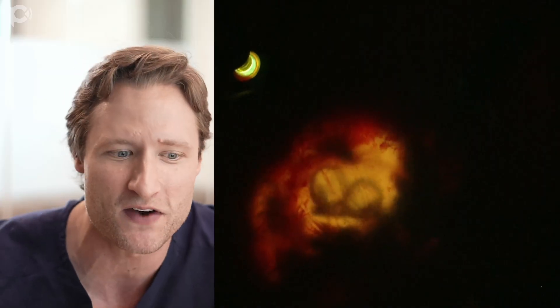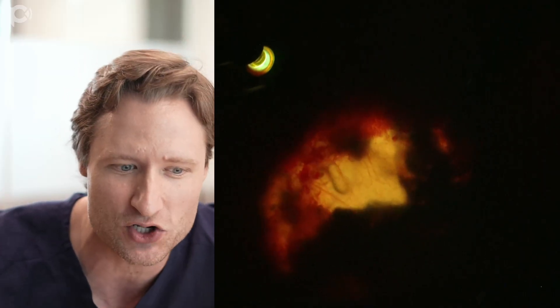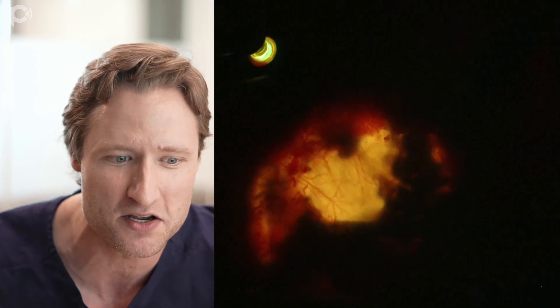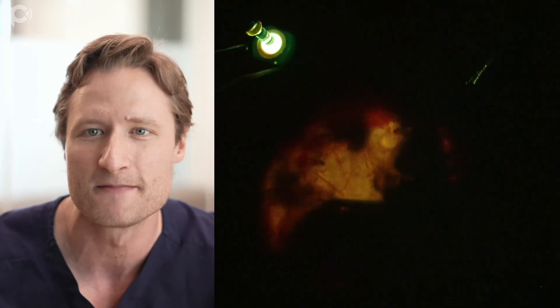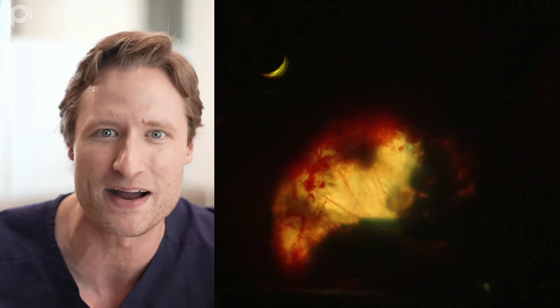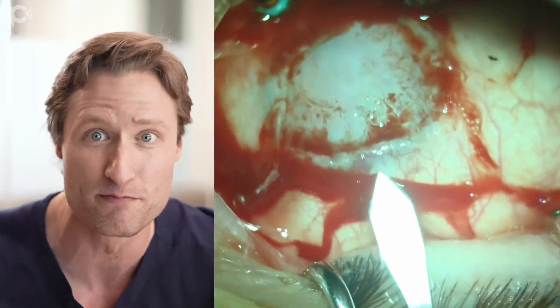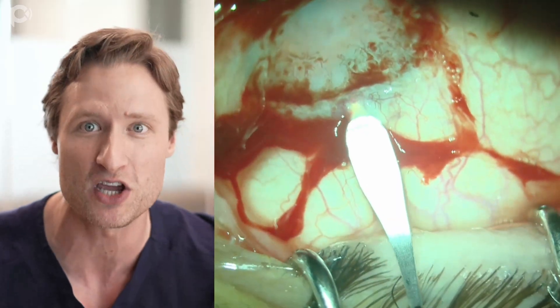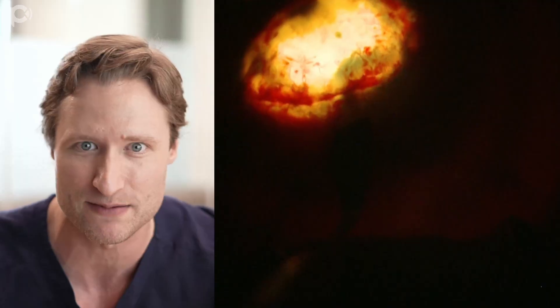So now I'm using a 25-gauge vitrectomy handpiece to vitrectomize all of this stray random iris tissue in the anterior chamber, along with synechiae and fibrotic membranes. And as I remove more of that iris, visibility improves into the eye. I'm gaining further confidence that this operation may be possible.